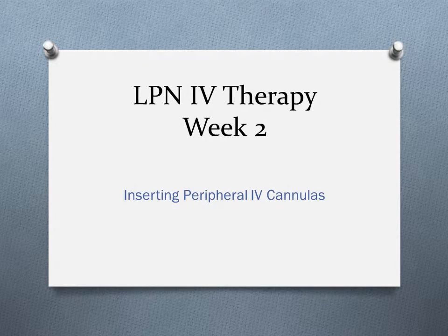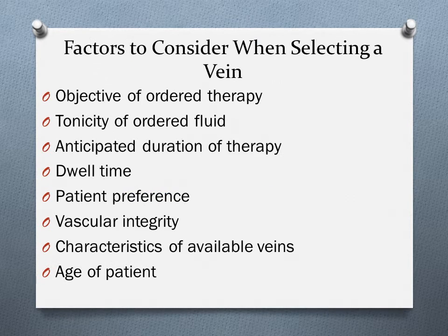So it's time to talk about inserting a peripheral IV cannula. The objective of ordered therapy is going to be hydration, IV drug administration, the administration of blood or blood components, or to establish a preoperative IV line.